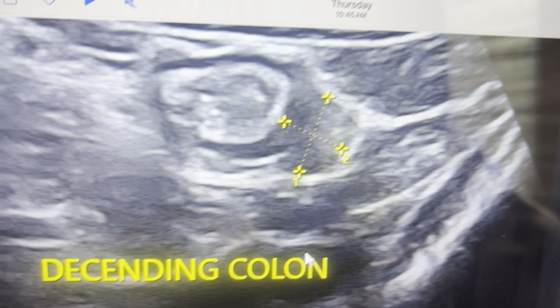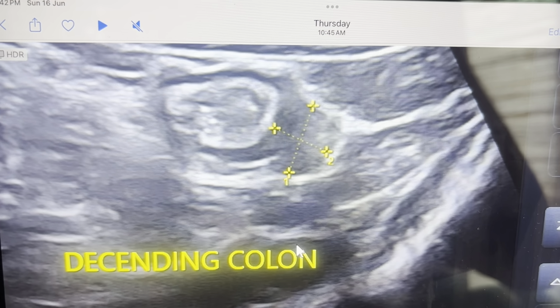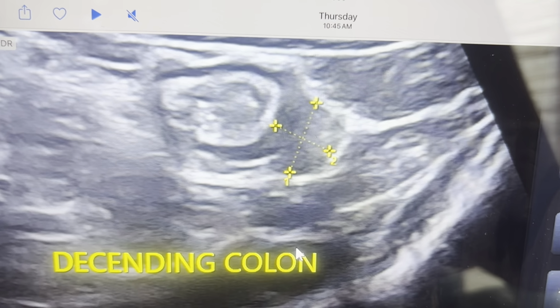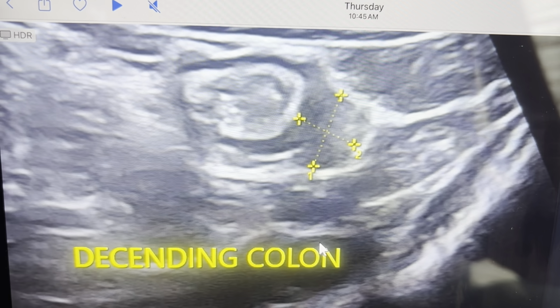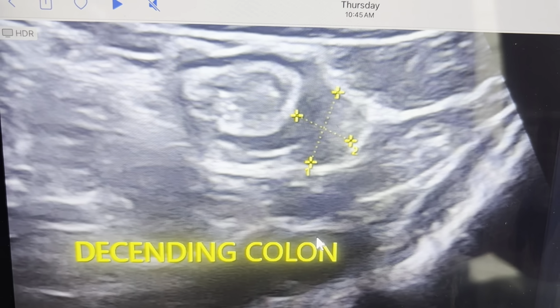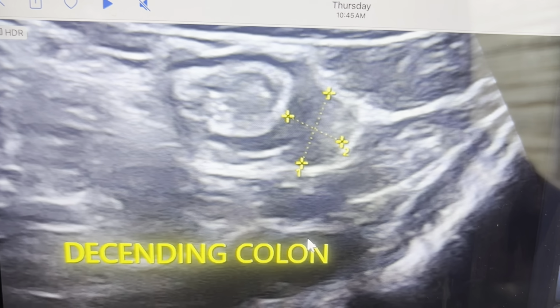It is a very fine diagnosis, and not so important if you miss it, but for giving a quality report and finding the cause of pain in the left iliac fossa, it is very important. If you have this kind of micro knowledge, then you can give a better report, a better diagnosis, and you can help the clinician reach the final diagnosis.